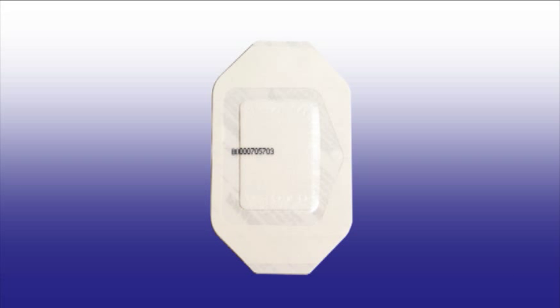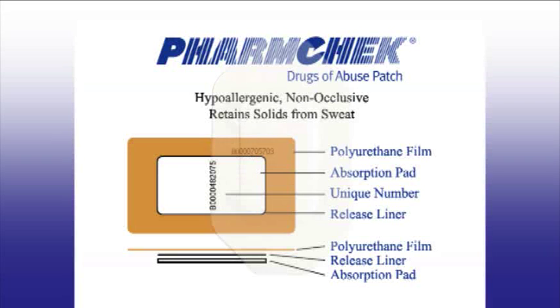This is what the PharmChek Patch looks like. The top layer of the PharmChek Sweat Patch consists of a polyurethane film. This covering is held to the skin by a hypoallergenic adhesive. The covering and the adhesive are manufactured by 3M. This substance is similar to the adhesive on wound dressings currently used in hospitals. Under the transparent covering is an absorbent pad — this is the portion of the PharmChek Sweat Patch that collects the sweat components and is tested by the laboratory for the presence of drugs of abuse.